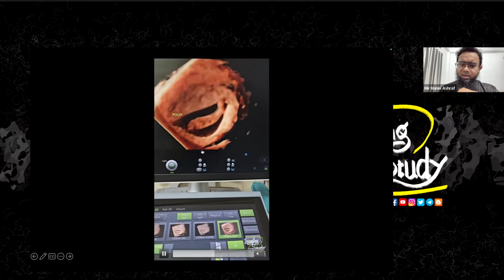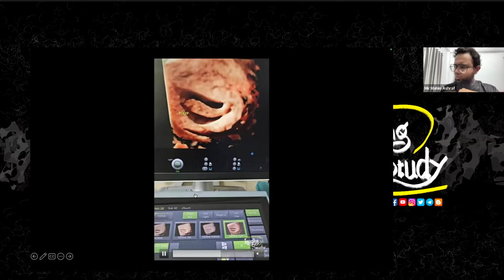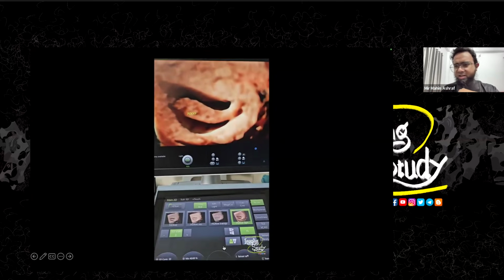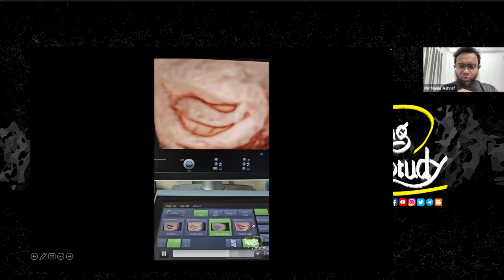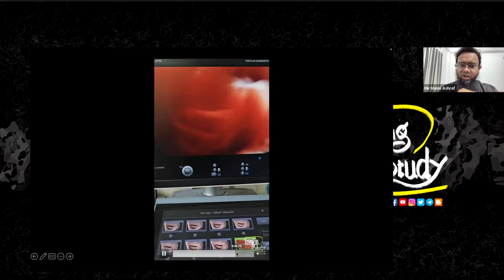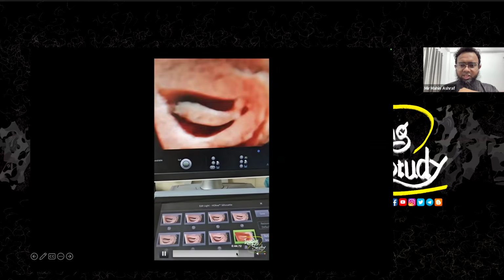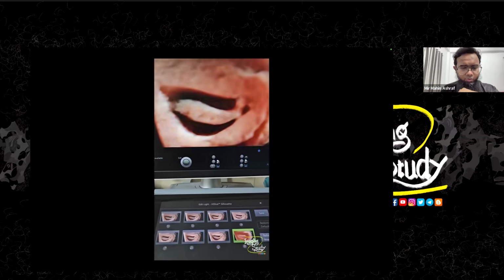So it's giving now a very good view, but never get satisfied. So you have to edit it a little. So I have magnified the image. Now, what can you do? You can change the modes. You can change the light source to give a good view. So I'm changing it from different angles and you can see these pictures look quite good.